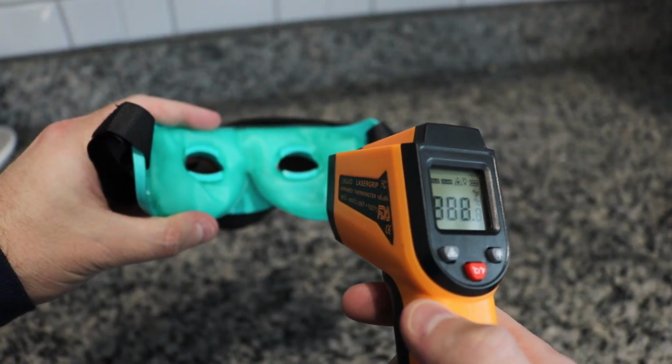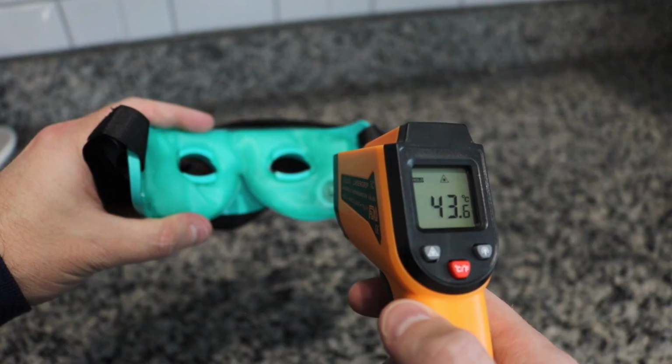Now there are a few stipulations to that, making sure that the warm compress is actually effective. You want to make sure the warm compresses can actually heat up your oil glands or your eyelids between 40 and 45 degrees Celsius. You also want to make sure the warm compress can retain that heat for at least 10 minutes. 15 minutes is preferred. You also want to be consistent with the warm compresses. You want to make it a routine, a dry eye routine. And this is where the TearRestore dry eye mask shines.